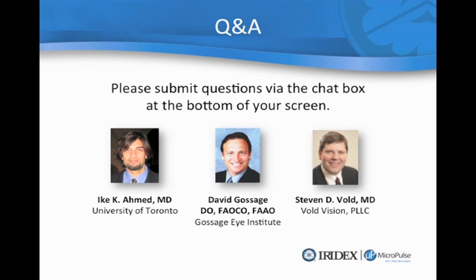I'll put in the 5% duty cycle. I'll leave it at 100 microns, and then I'll double the power setting from where I left off and double the duration. So if it's 100 millisecond duration, it goes up to 200. If it's 100 milliwatts of power, I'll double that to 200, and then I'll go ahead and treat. What I do is use a high-density treatment over the area of the retinal edema. So what you're doing is putting in almost like a PRP right over the area of edema, whether it's over the foveal avascular zone, whether it's directly on the fovea. You can go ahead and treat it and feel comfortable that you're not going to cause any thermal damage. Afterwards, if you were to shoot a fluorescein on them or do autofluorescence on them, you're not going to see any change in the retina at all afterwards with these settings.